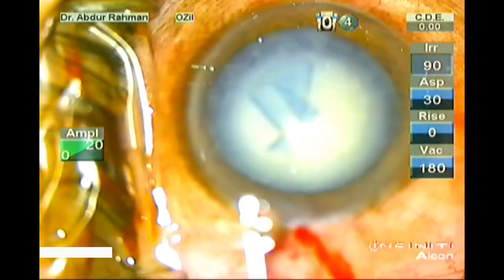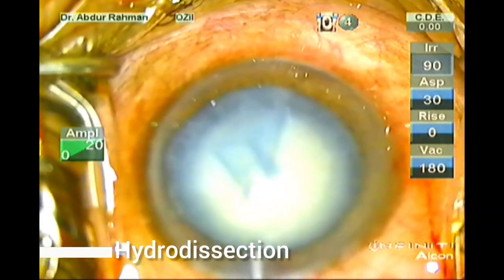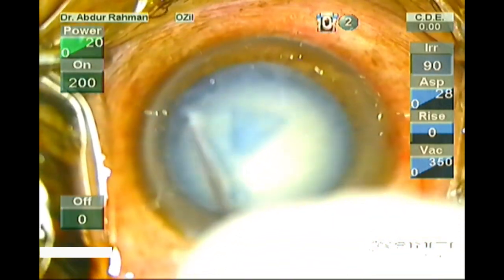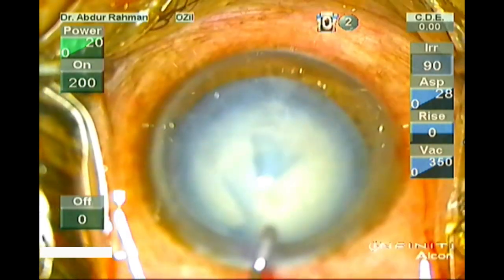Now I will perform hydrodissection. Tap the center of the nucleus. I can hydrodissect. Yes, I think it is adequate.